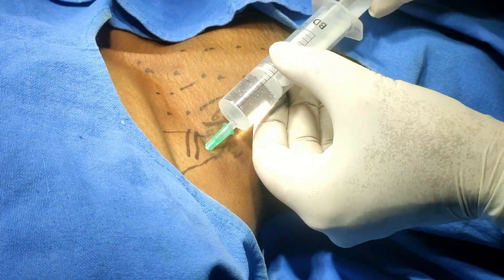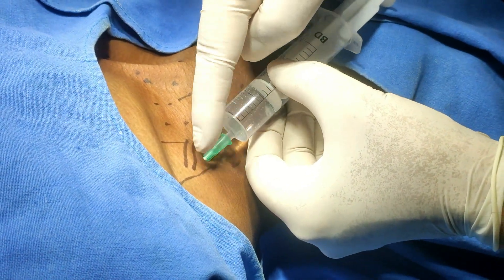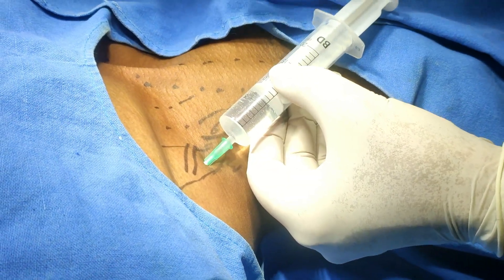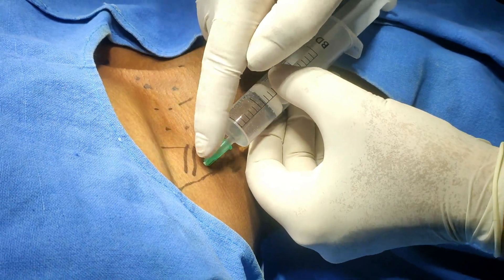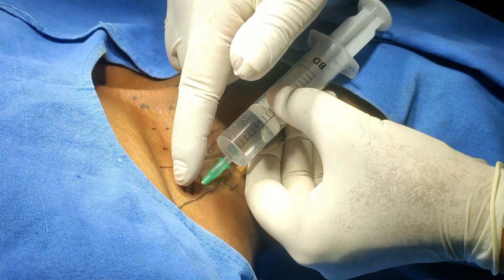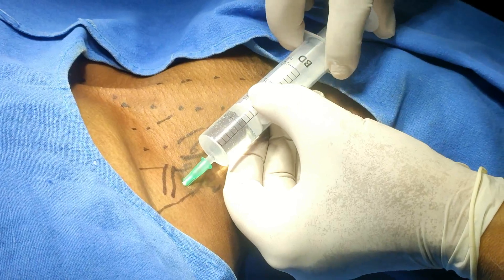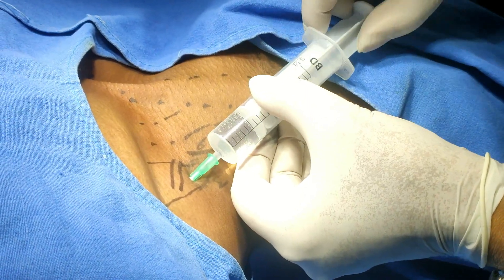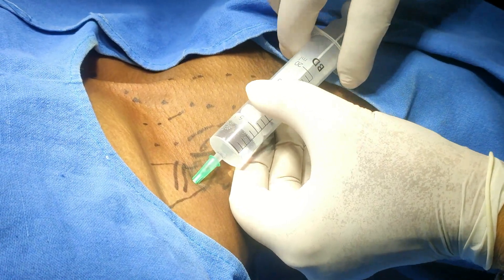We have designed two techniques: one is supra-omohyoid and another is infra-omohyoid interscalene triangle. If the belly is placed much lower, you always give the supra-omohyoid block. If it is up, then you can insert the needle in the infra-omohyoid interscalene triangle. This is based on basic anatomy, and our aim is not to elicit any paresthesia.